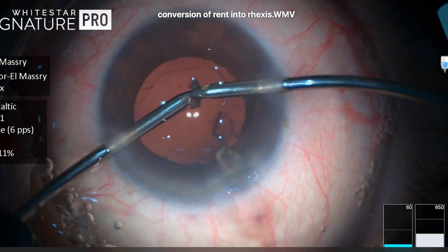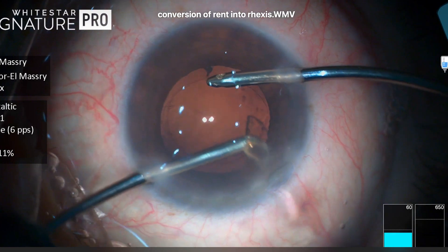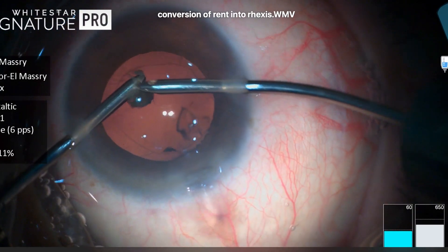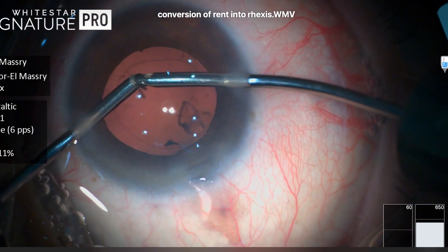Here there were some nuclear shards or nuclear fragments that were hiding either above the iris or inside the wound. So here I was just taking them out with the I/A, but the posterior capsule was engaged in the aspiration port.